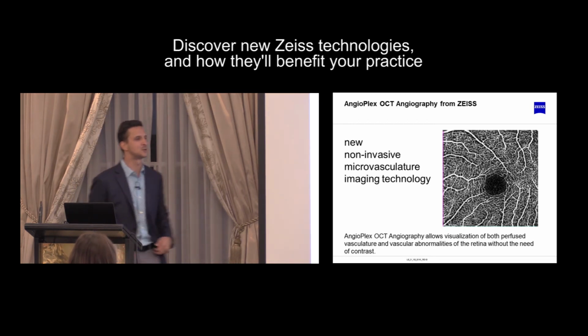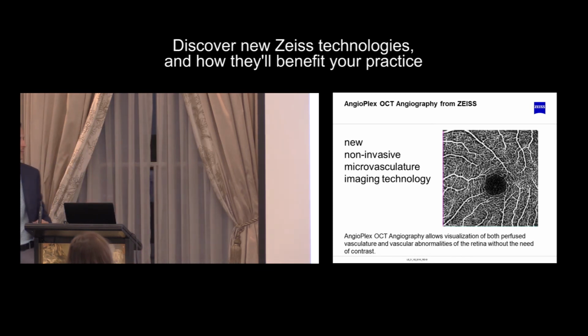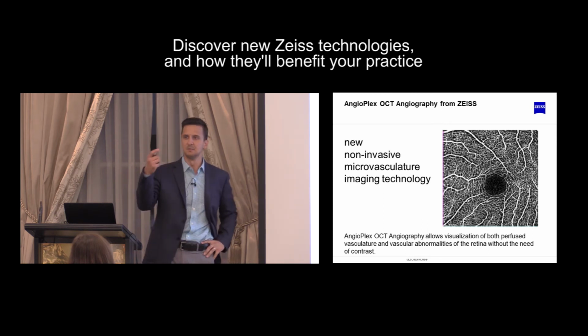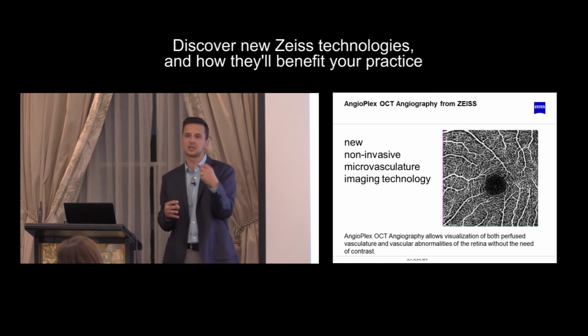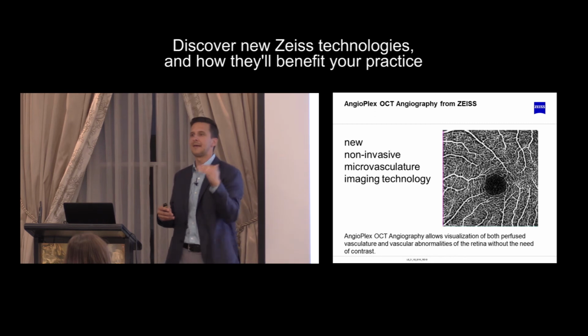So with that, OCTA. I'm just going to touch on a couple of quick things here. We have been running OCTA since early October of 2016. The unique thing about OCTA is that anything in white on this particular image is the movement or the change in the erythrocyte through the vessels. And this is depth-resolved, so you can set this at different depths in the retina, and you can color code those depths, which I'll show you in a moment, so that you know which layer that vascularization is occurring at.